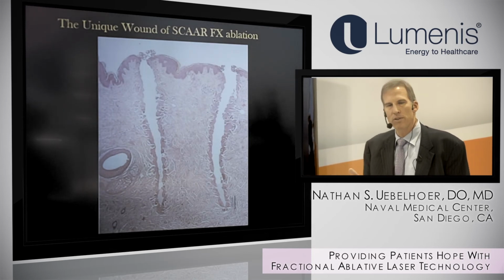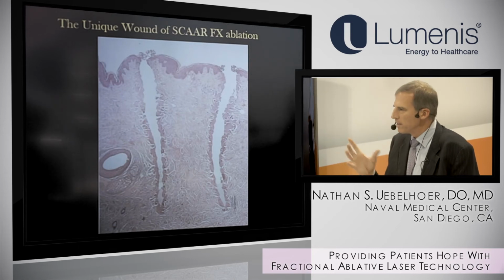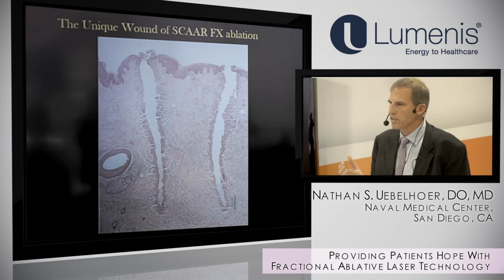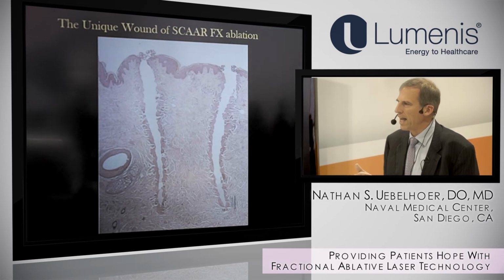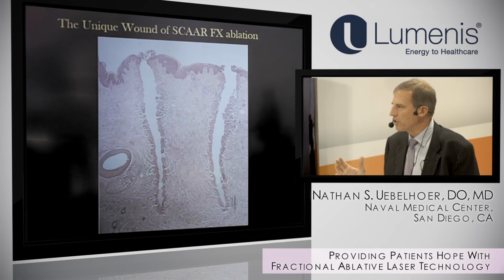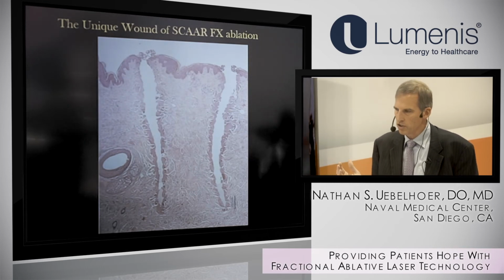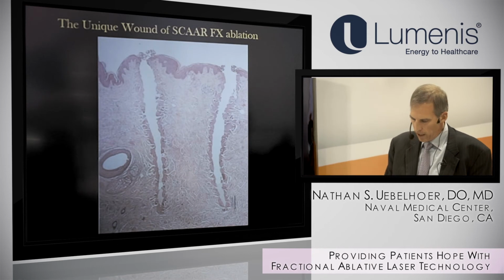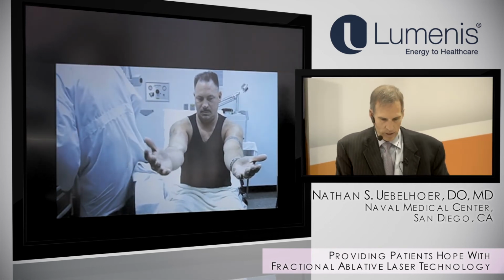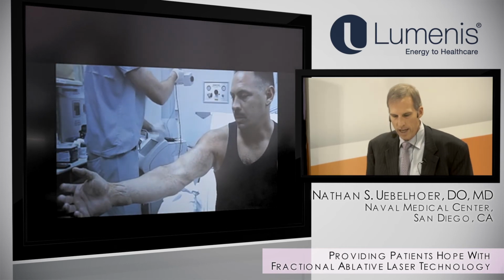After you've treated 1,000 patients, then start playing with the settings, because I see so many patients that have been re-injured and have devastating results when you increase the energy and increase the density of these treatments. So keep the density low and the energy high. And here's really quickly, I don't know how much more time I have, but here's an example treatment.